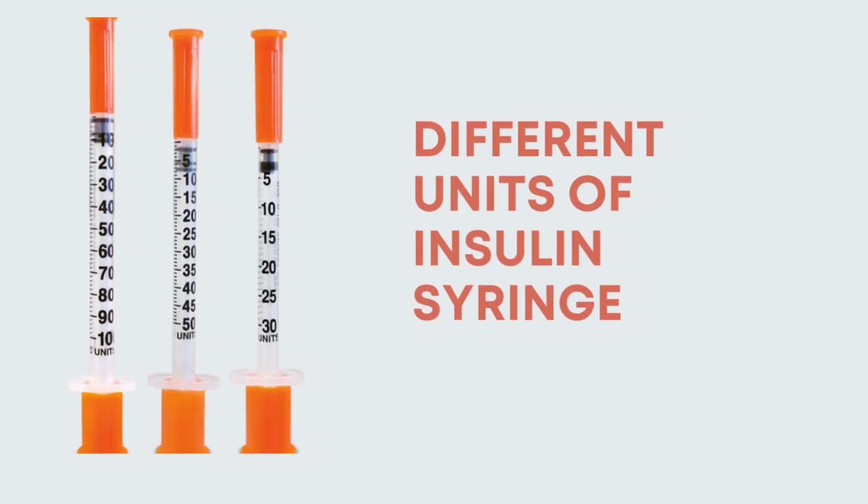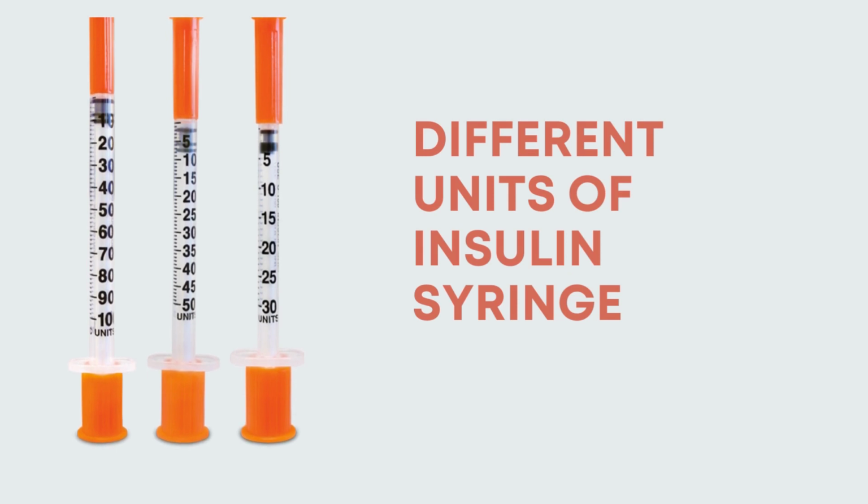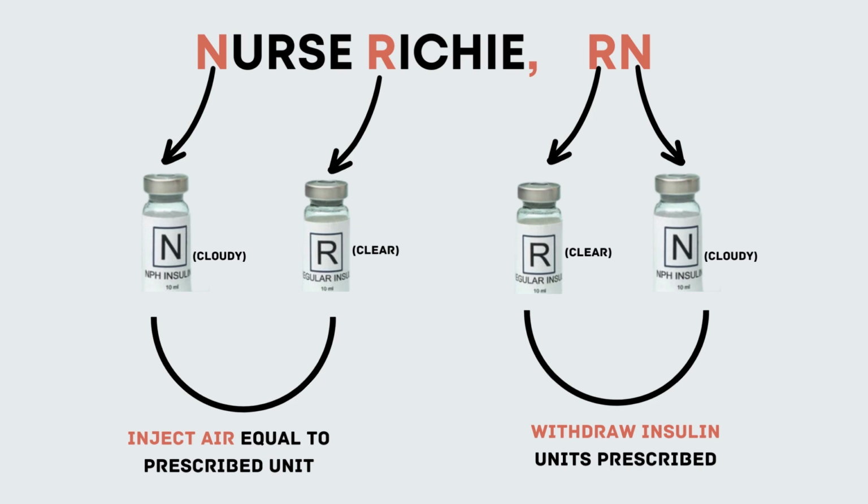Talking about syringes real quick, the more common typical insulin syringe is the 100 unit. Unit is our way to measure insulin instead of milliliters or liters. We use the word units. So we have the 100 unit, we have the 50 unit, and the 30 unit. All right. So depending on the sum total of how much is to be administered, you can pretty much figure out which one to use. Your facility should pretty much have these different sizes of insulin syringes, and that gives you an idea of which is best. So now let's go into how to mix these insulins in one syringe.